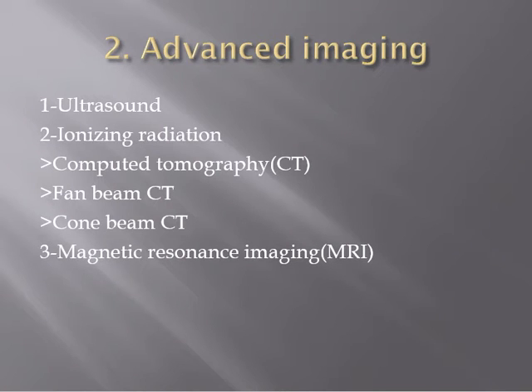I am going to talk about the second part of the diagnostic imaging in oral and maxillofacial surgery. Advanced imaging. Types of advanced imaging: ultrasound, ionizing radiation, computed tomography, fan beam CT, cone beam CT, and magnetic resonance imaging. Advantages of advanced imaging: three-dimensional and cross-sectional imaging.